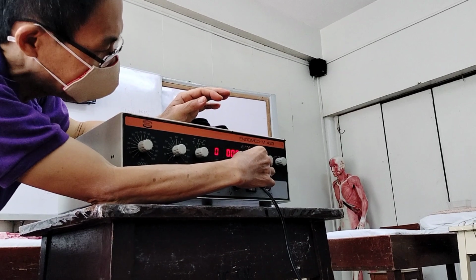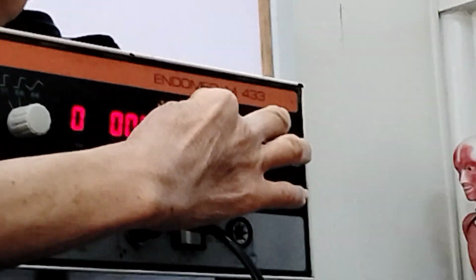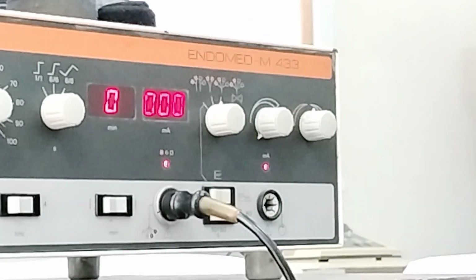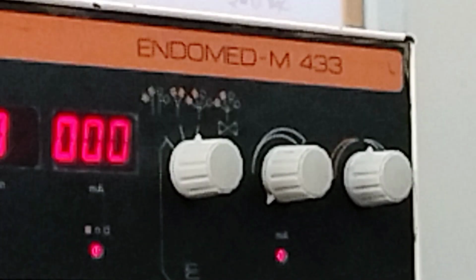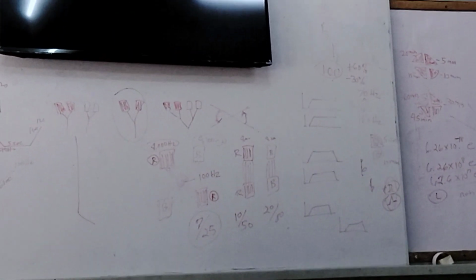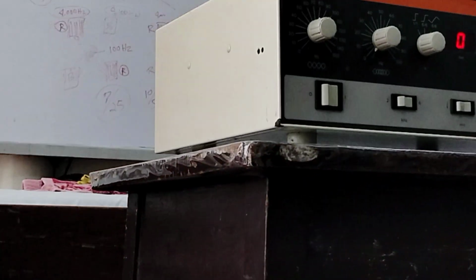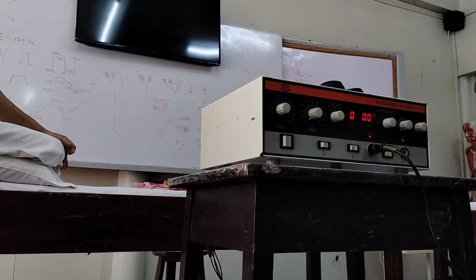Next, further going towards the right, the third one. You can see the symbol. There are now 4 electrodes, two red or orange and two black. So we call this method now quadripolar, or the 4-pole method. Quadripolar, 4 poles, so you have to use 2 pairs of electrodes, or 4 electrodes.